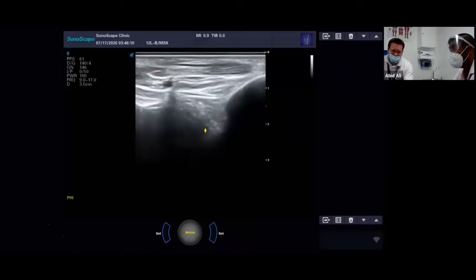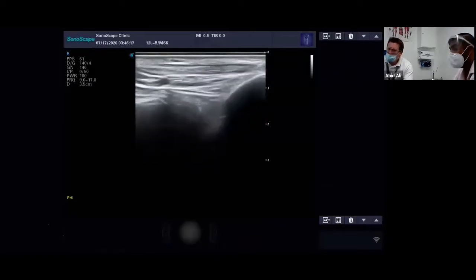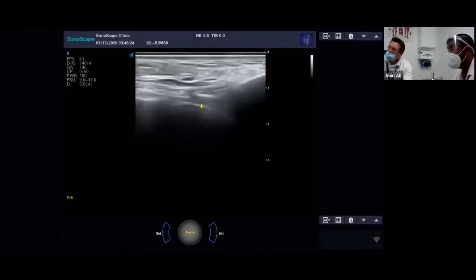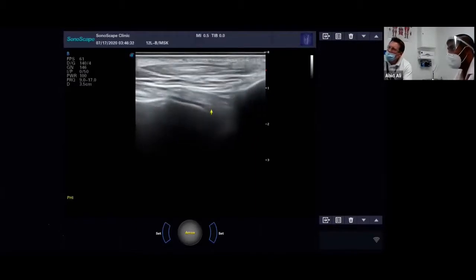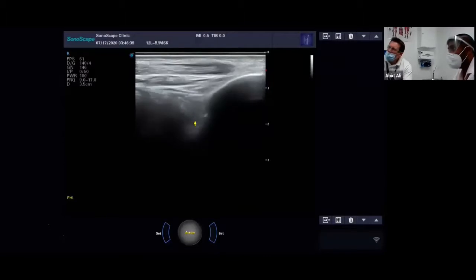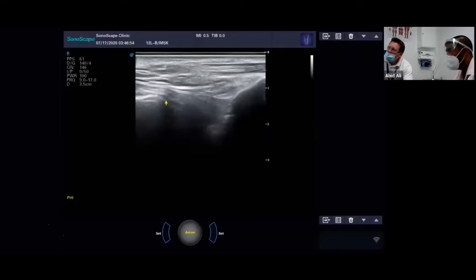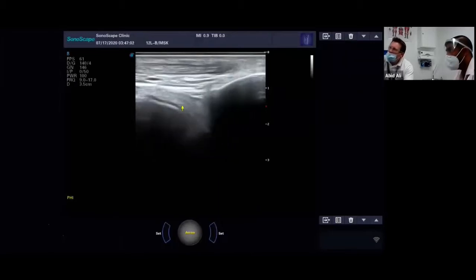I mean, even the tendon at the top of the screen here, if I just get that back in view. So you can even see me gapping the ankle joint, which we'll do here. So we'll just get a nice view again. Okay, so let's gap the joint and the tendon. See it opening up here. If it's an arthritic joint, we tend to see narrowing of the joint space, so you won't see this nice V shape. Do you want to just point out the cartilage, so you can see the black halo overlying the bone. I'm just trying to clear that up for you. Oh, you bring the focus down. Oh, perfect. So that's the cartilage at the top of the talus.